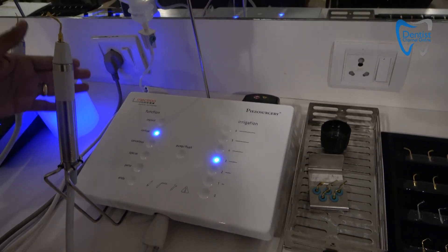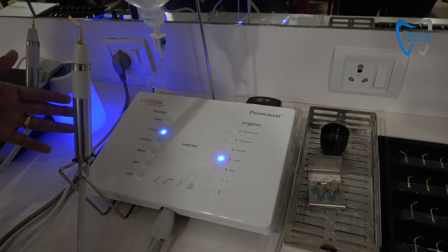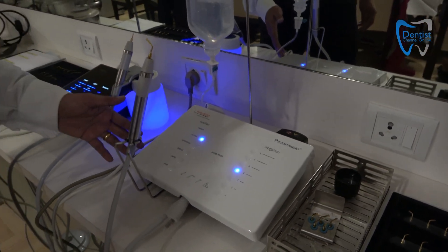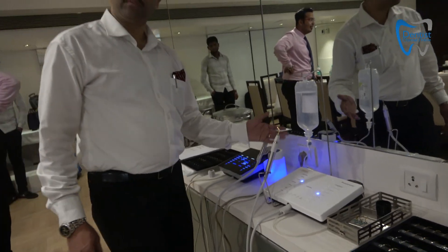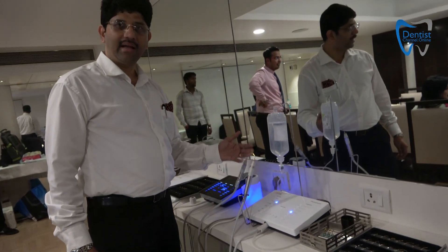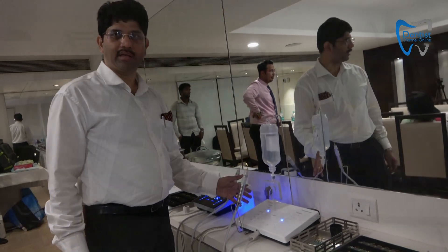With this machine you will be able to do your implant, cortical, cancellous, facial, perio, and endo functions. You can do a ridge split, your sinus lift, implant — everything and anything except scaling activities is available in this particular machine.